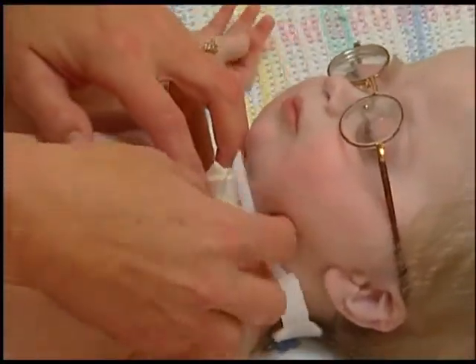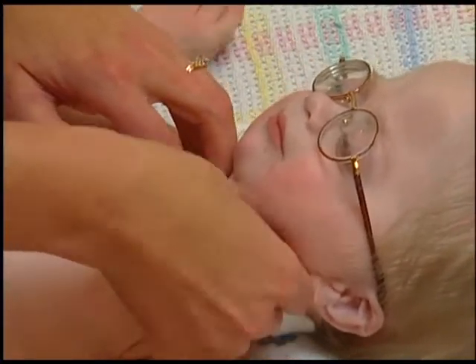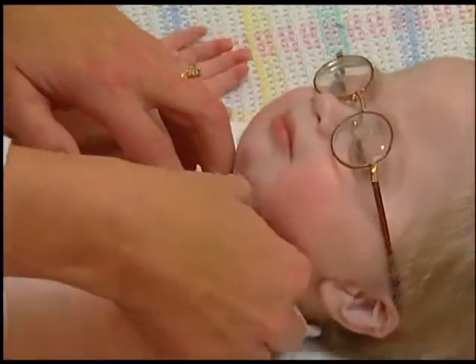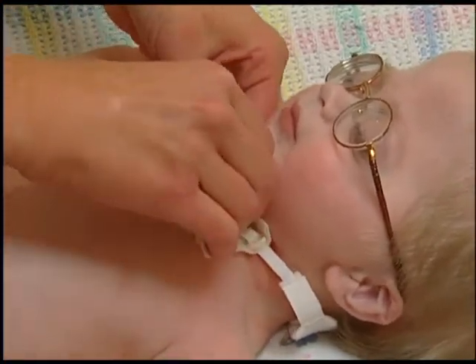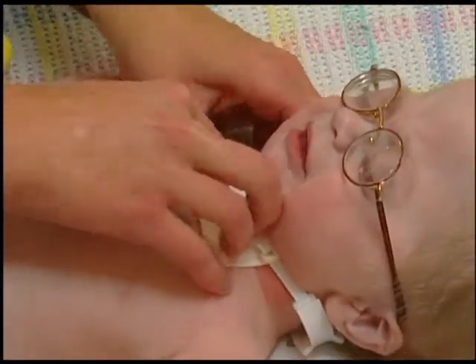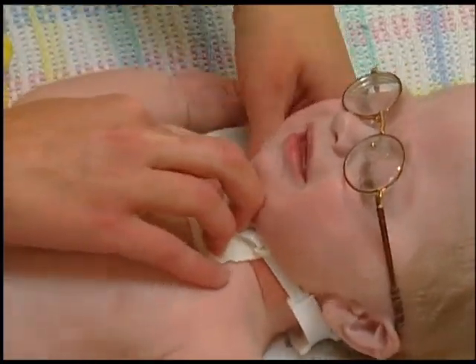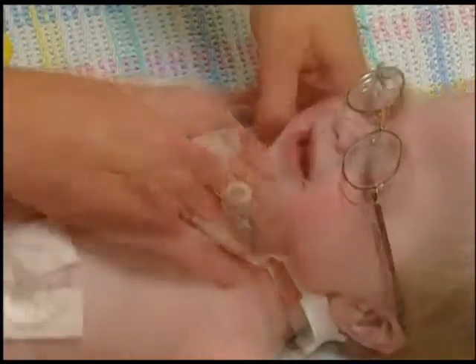If using a pre-cut split 2x2 trach dressing or stoma pad, slide it into position after the area is clean and dry. Be sure to hold the tracheostomy tube in place while positioning the gauze pad. Do not cut gauze because the child may inhale any loose strings. Be sure to change this dressing anytime it is soiled or wet.